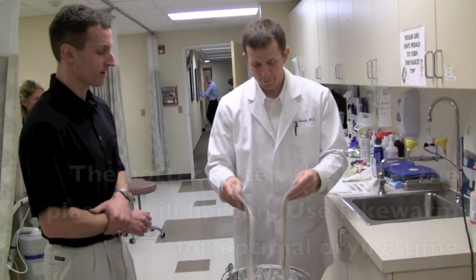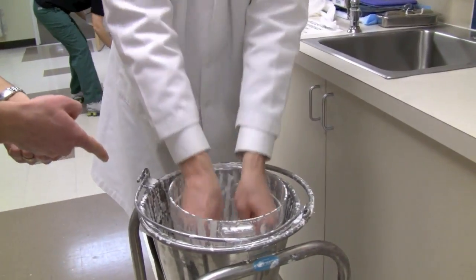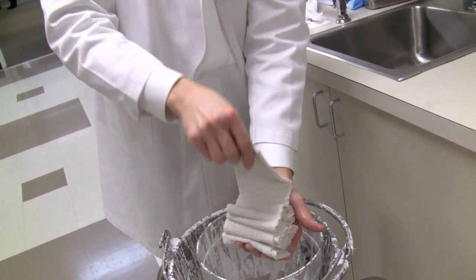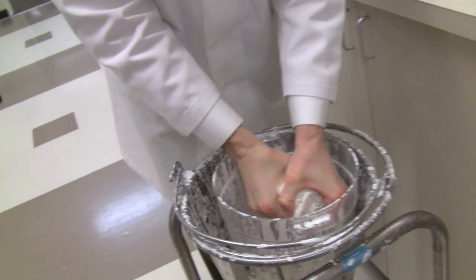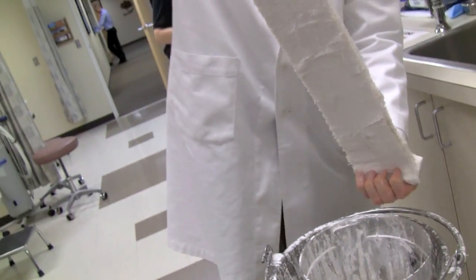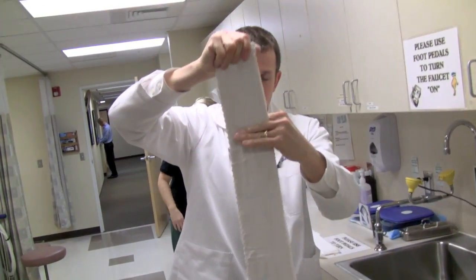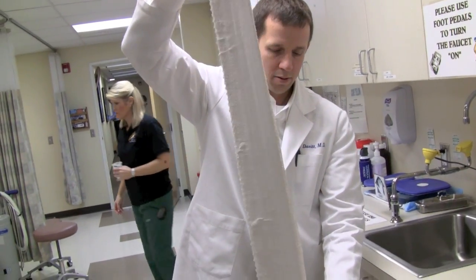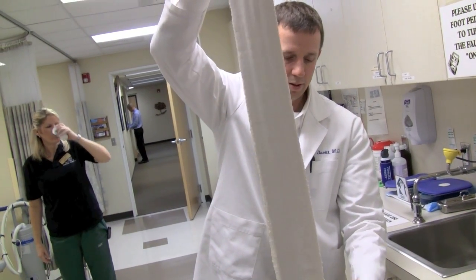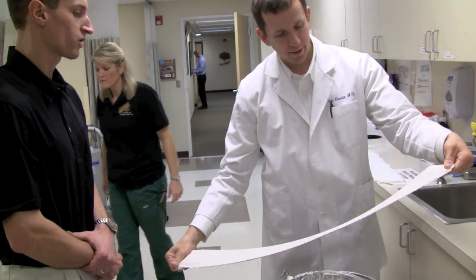Use lukewarm to warm water. He's got two hands going down into the water to fully saturate it. Let it drain — give it a good squeeze to drain most of the water out. Then pull it up straight, and you can run two fingers on both sides. That just helps move the plaster and spread it out between the layers so you end up with a nice smooth sheet.